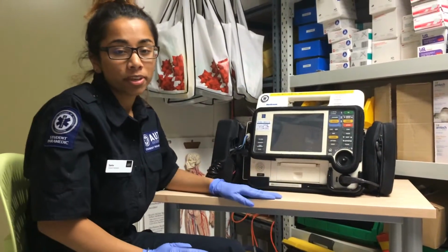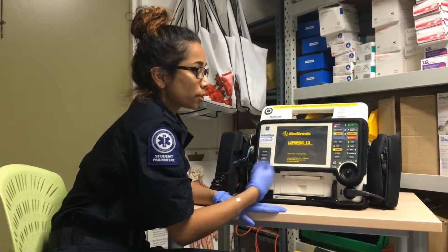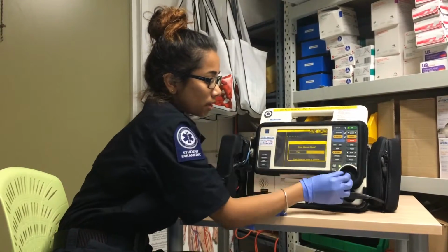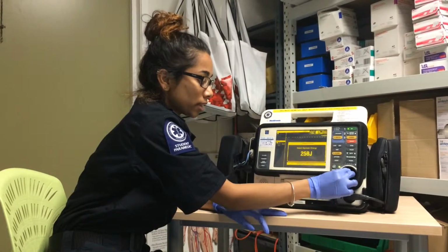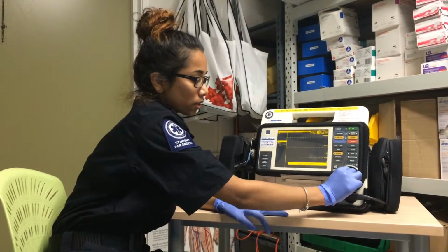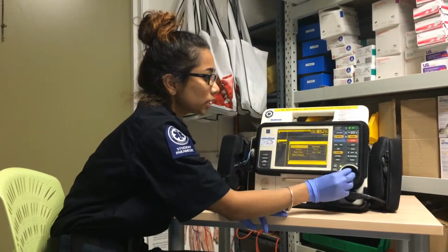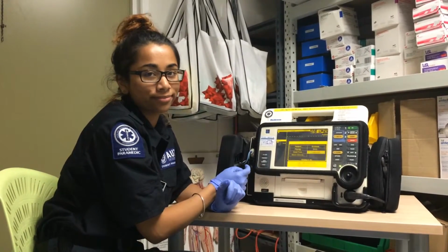So to turn on the LifePak 12, you want to press the green on button like so, and we want it on manual mode, so we'll be clicking Energy Select, and we want to turn the dial to yes to change the manual mode, and we'd want to bring it back down to 50 joules for our test. So to do an operational test, you want to click Options, scroll down to User Test, and it will print out a user test for you.